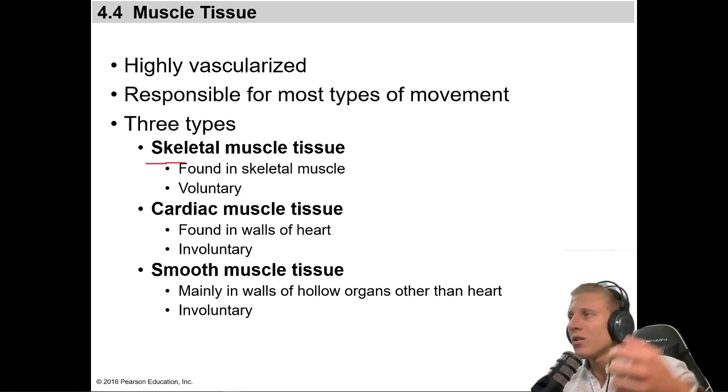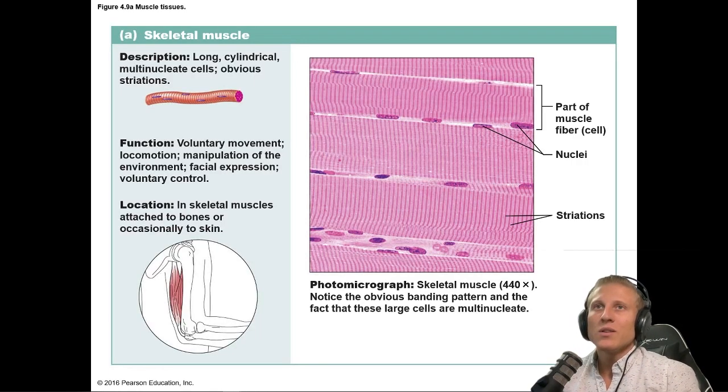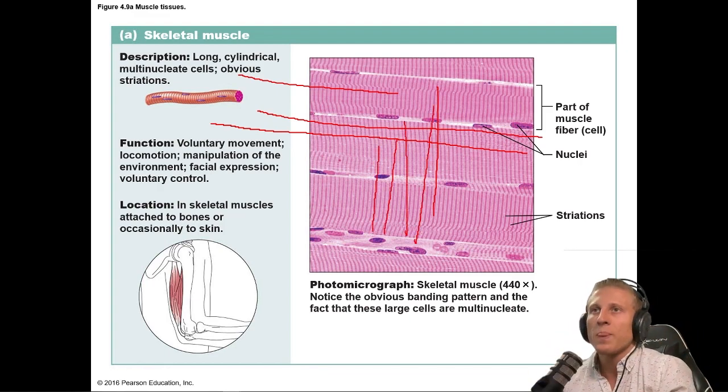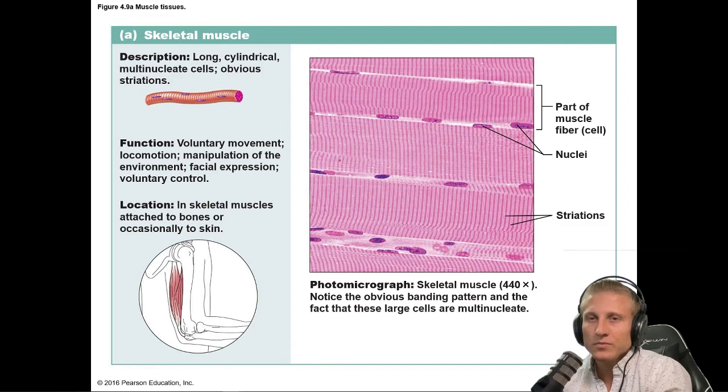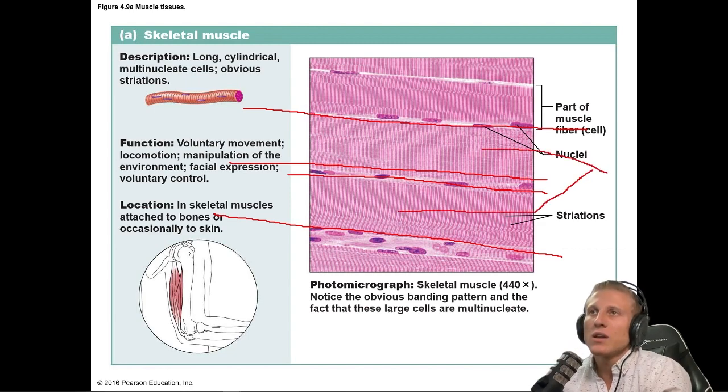And this is found in all the things that you would typically think of as skeletal muscle. Cool. What does it look like? Well, it looks something like this. So we have a nice uniform striation occurring, striations in this direction, cross-sectional functional groups that accomplish contraction. But then we have the general orientation of muscle fibers being uniform in their direction, right? They're running this way. And all of these are nicely segmented. There's no branching occurring. They're not connecting, like this one isn't connecting into this muscle cell over here. That's important as a distinction for cardiac fibers.